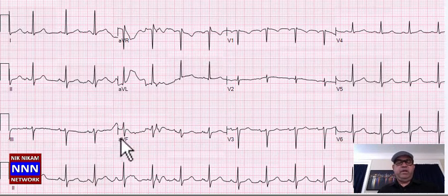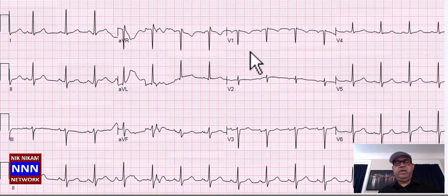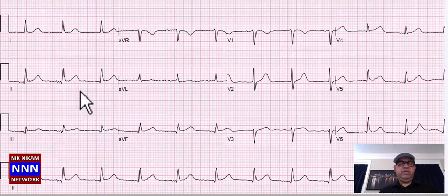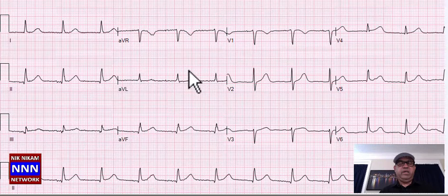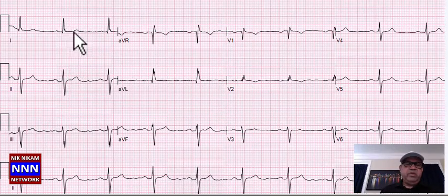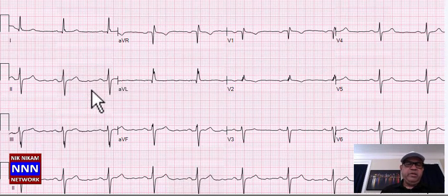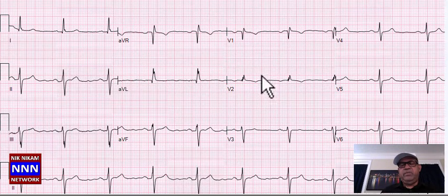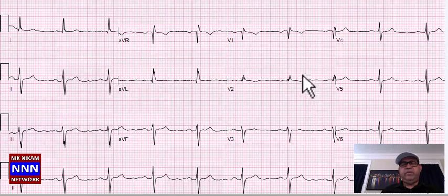Sinus rhythm, inferior leads look okay, anterior leads: some T-wave changes — non-specific ST-T changes, nothing really acute. Sinus rhythm, inferior wall okay, anterior wall okay, AVL looks okay. Sinus rhythm bradycardia, left axis deviation, non-specific T-wave changes, incomplete right bundle branch block. Complete right bundle branch block with sinus rhythm, PACs, some T-wave changes — non-specific T-wave changes, but nothing really significant. Sinus bradycardia, T-waves in inferior leads okay, anteriorly some increased voltage — nothing really significant.